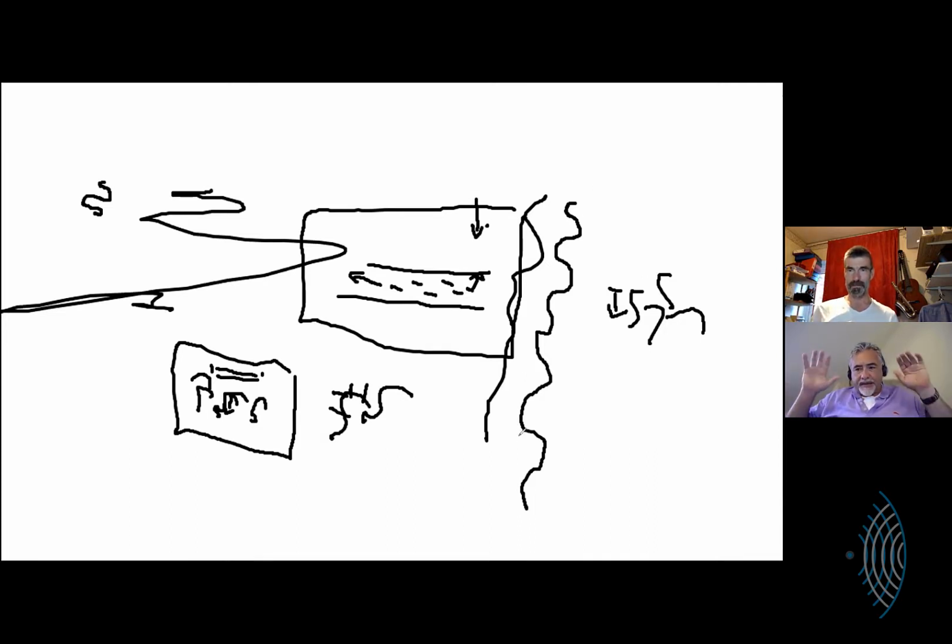Completely phenomenal to me. I don't even know where I would have learned this, because none of the books I've read even have this in there. So here's the thing that's troubling to me. We've established that these 10 sine waves from the Doppler interrogating pulse go down. I would assume they're then listening for the shift in frequency when it comes back, in order to know whether the red blood cells are going away from or toward me.